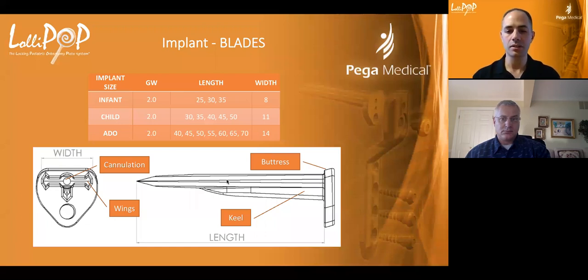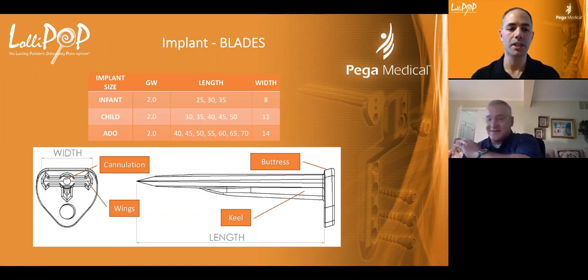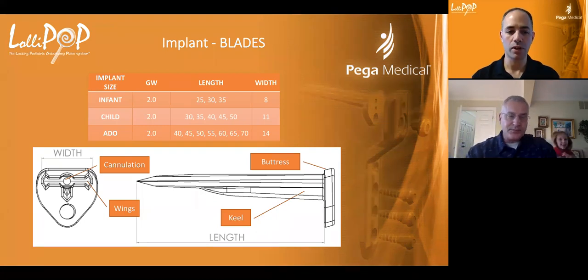And then you have a keel that gives it additional bending stiffness, but also rotational stability. If you look on the left image at the front view of the blade, you see it's almost like a Batman sign geometry. So that prevents any lateral cutouts or any rotational issue.